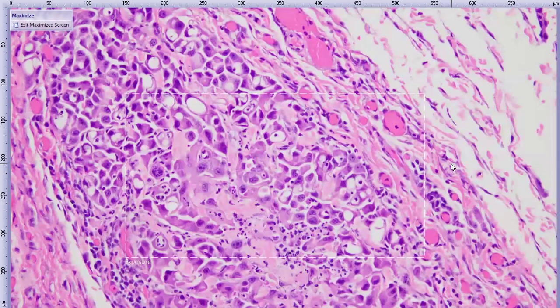The other reason why I thought this case would be nice and instructive, in addition to how interesting the morphology of the cells is, is that this case presented clinically as a uveitis case. So a brief discussion on things that can masquerade as uveitis clinically, but aren't uveitis when we do the histology. Some of the things that clinicians might use to determine a diagnosis of uveitis might be, for example, aqueous or cell flare, so cloudiness in the anterior chamber, which is exactly what they said in the history of this patient. But in this case, that cloudiness was probably produced in large part by floating neoplastic cells.